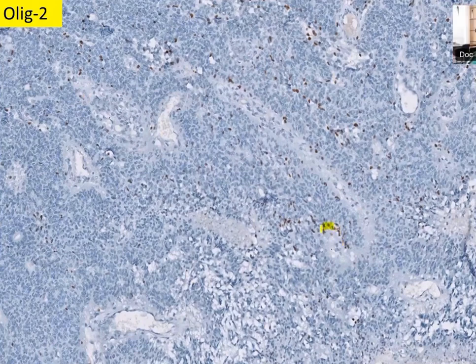Mostly a few cells around are positive, but mostly it is negative. Ependymomas are always OLIG2 negative. Whenever you get strong OLIG2 positivity or more than 20-30% cells positive, stay away from the diagnosis of ependymoma. There are a lot of ependymoma mimickers, so you can use OLIG2 as a good marker to differentiate from them.